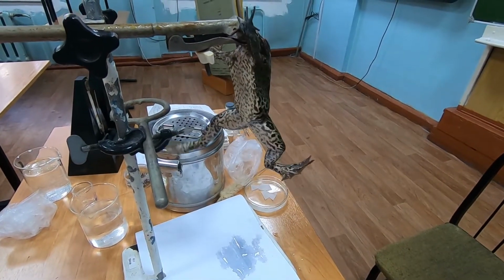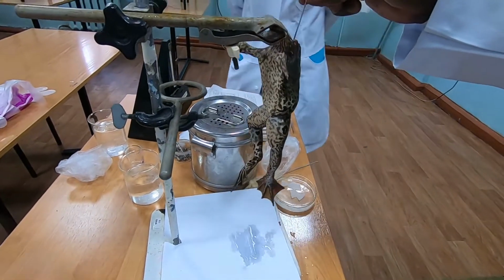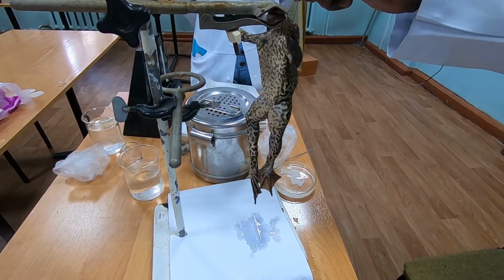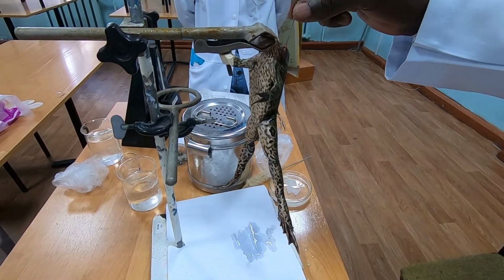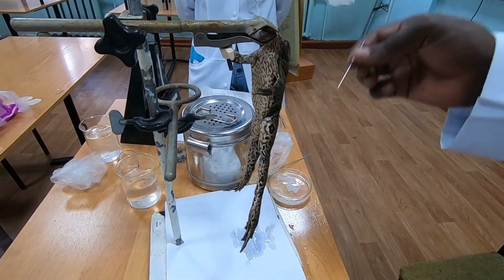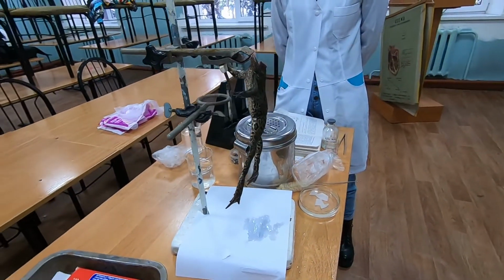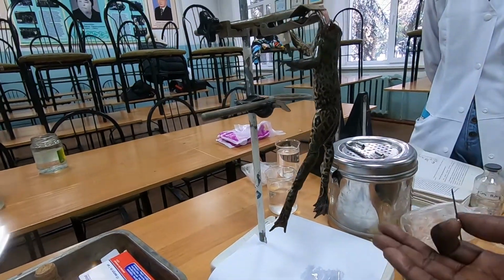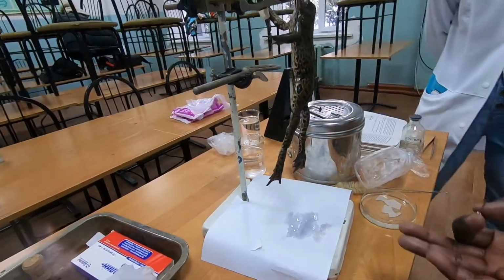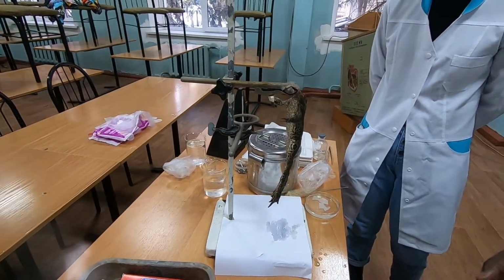You can see we can paralyze it now if we want. We are paralyzing the central nervous system. You have already seen this before, right? So the difference today is that we apply different concentrations of sulfuric acid to different parts of the body.